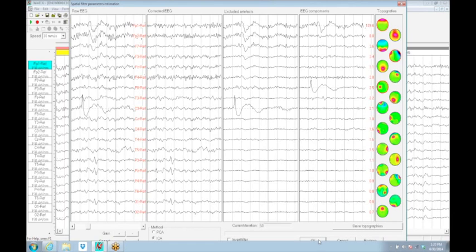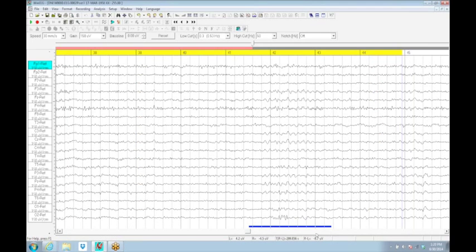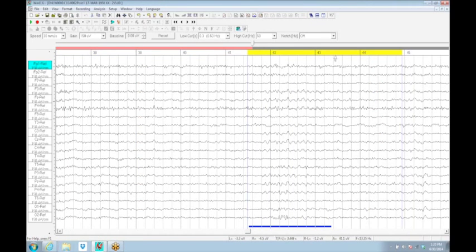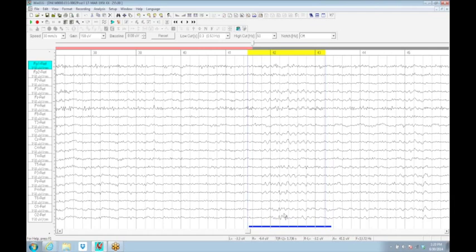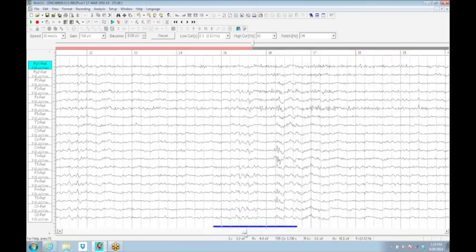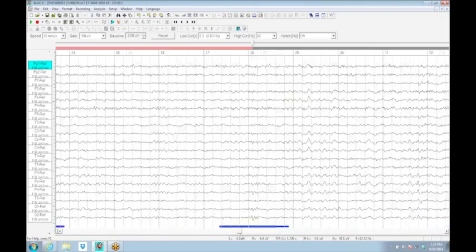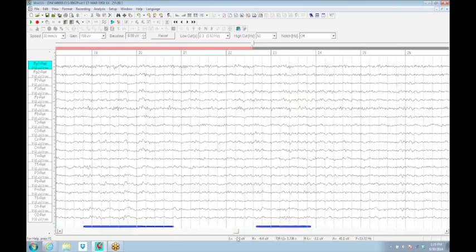The one thing I don't think anybody would argue is that artifacts are not Gaussian in their distribution. As such, the non-Gaussian nature of the artifact allows the ICA to be particularly well adapted. It's pulling out these non-Gaussian components very nicely as isolated pieces. If I click OK, we can go back into the EEG and we can see this piece of EEG that we would have thrown out is perfectly nice. We didn't really need to throw away this bathwater to get rid of that eye blink baby.